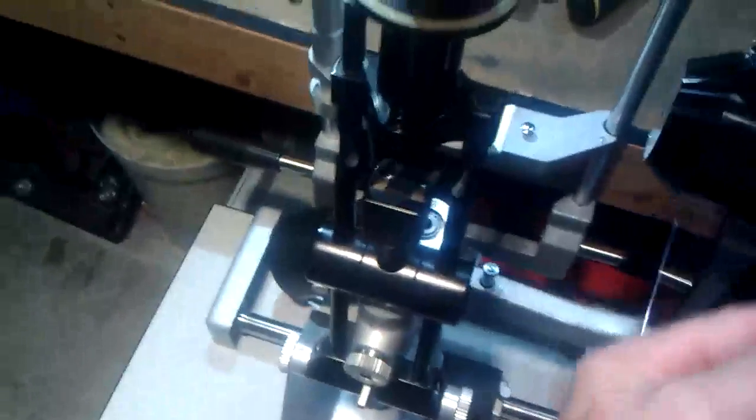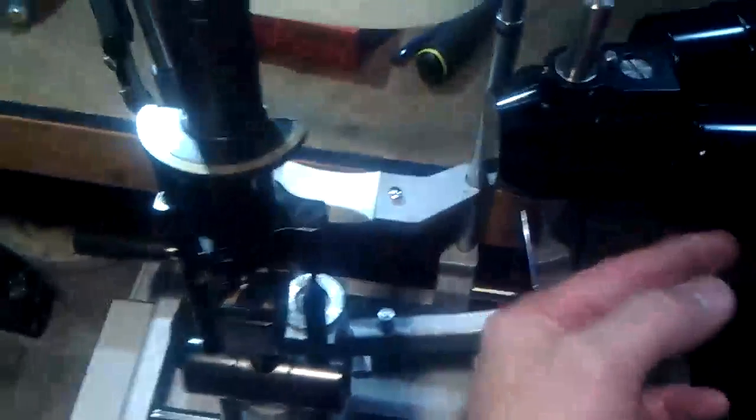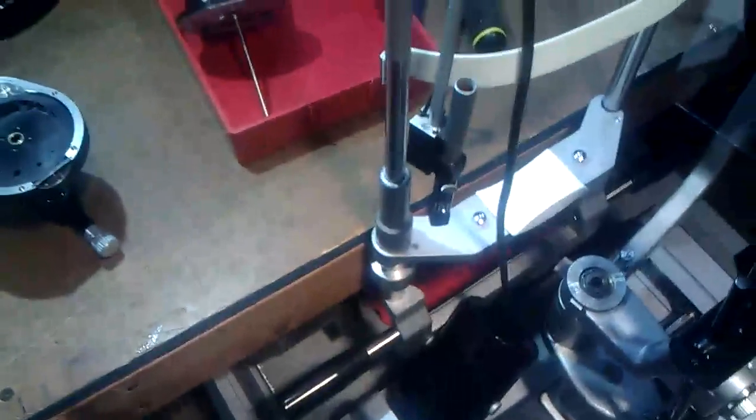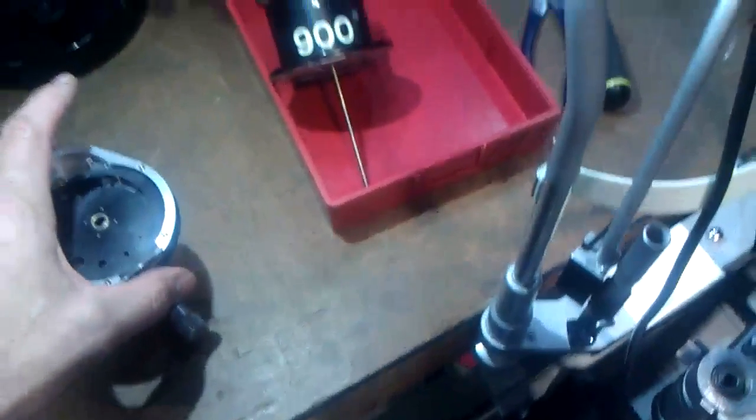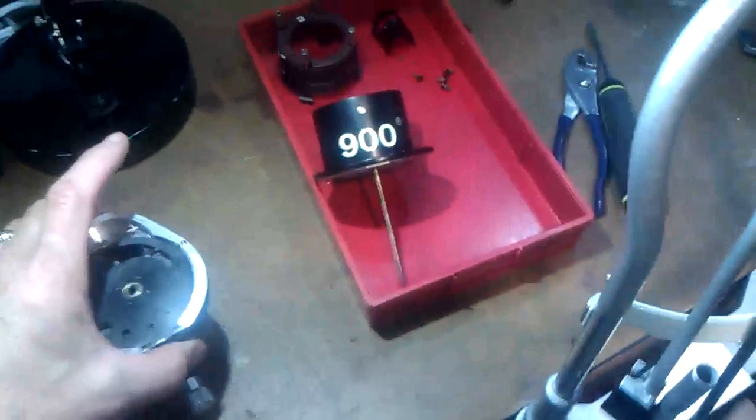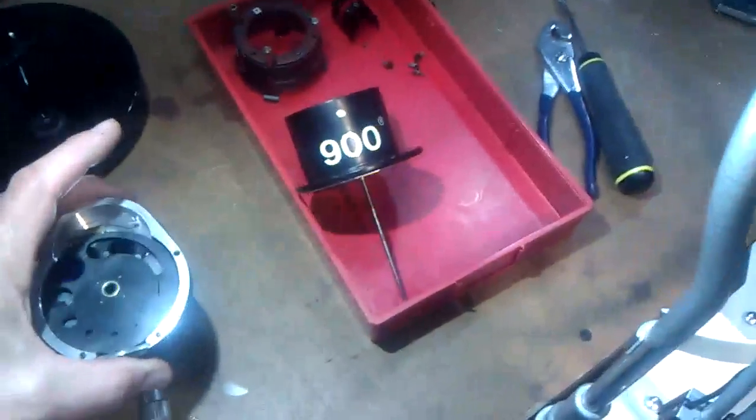Welcome back. Today we've got a Haag-Streit 900 slit lamp and the optics inside aren't too good, so we need to clean those up. We're also having some alignment problems with the beam coming off the mirror, so we're going to go in and fix that too.